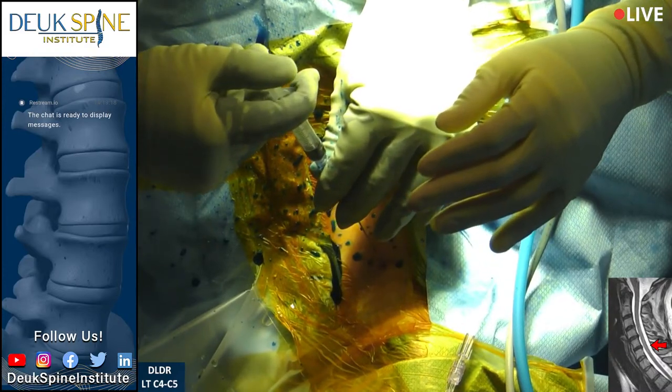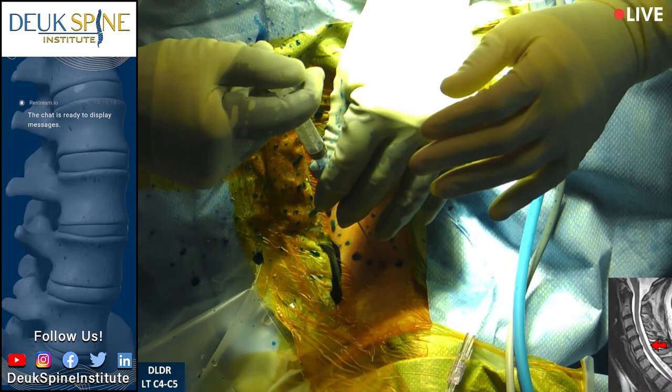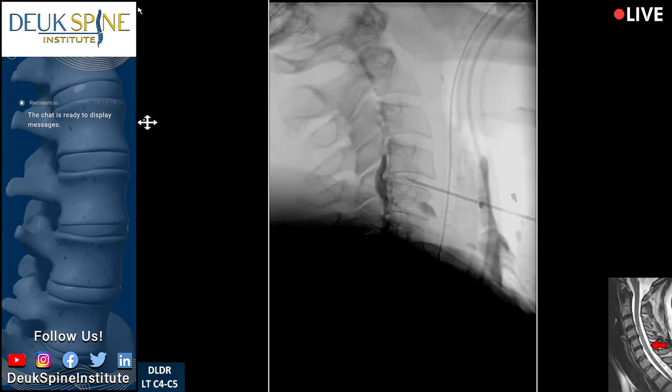There it is — that's impressive, folks. Look at the dye in the epidural space. All that black right there is because dye leaked out from the disc through a tear in the back of the disc. That's the tear right there — the dye literally went through the tear in the back of the disc and into the epidural space. The herniation is right there — it's devoid of dye, so the dye is highlighting the herniation. You see how the dye has an indentation — a concavity — that's actually the herniation in the back of C4-5.